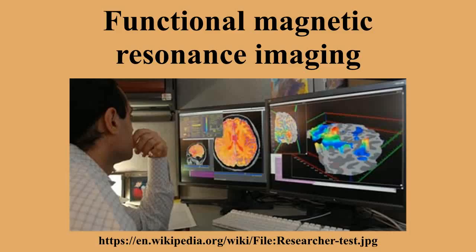With these, fMRI can examine a spatial range from millimeters to centimeters, and can hence identify broad areas, subcortical nuclei such as the caudate, putamen and thalamus, and hippocampal subfields such as the combined dentate gyrus, CA3, CA1, and subiculum. Temporal resolution. Temporal resolution is the smallest time period of neural activity reliably separated out by fMRI.